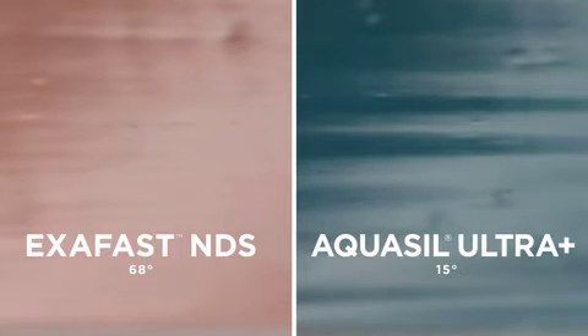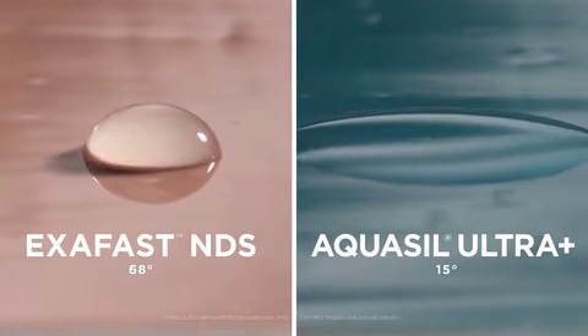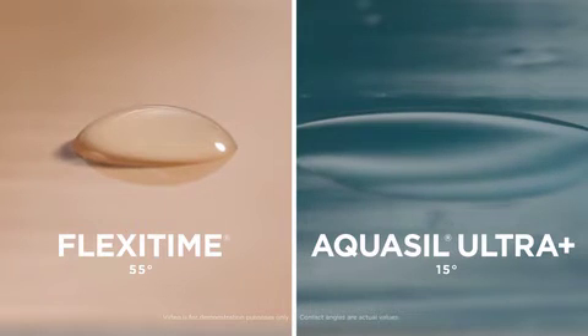A drop of water is placed on samples of both Aquasil Ultra Plus impression material and a competitor's material to test the contact angle. Our material gets to work right away in moist, humid environments, addressing the risks of impression errors due to voids at the margin from the get-go.